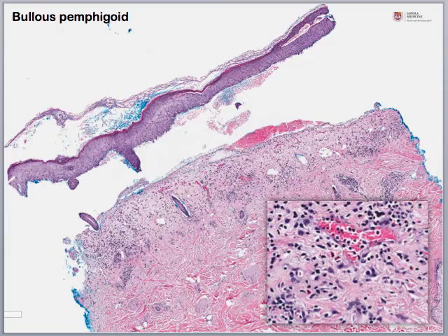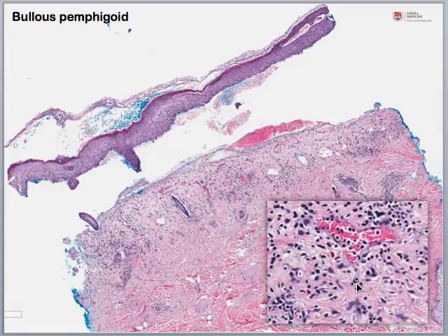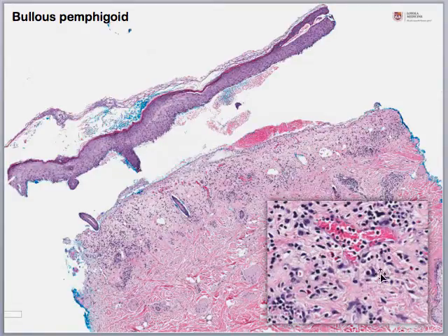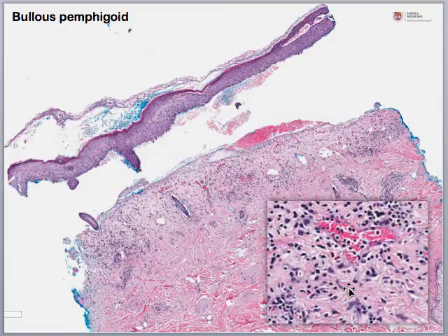Our next case is very classic. From low power view we can see a subepidermal split — the epidermis and dermis are separated. On higher power view, we can see all these granular red cells within the inflammatory infiltrate, and those are eosinophils. So if we have subepidermal clefting with eosinophils, we think of bullous pemphigoid. Generally in this case we would also have direct immunofluorescence showing positive linear deposition of IgG and C3.